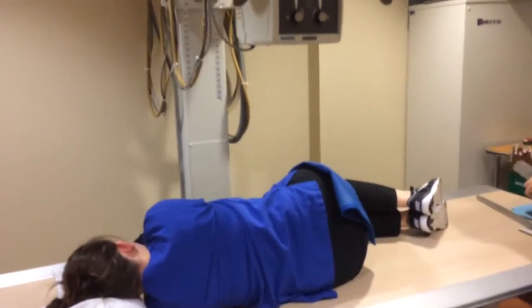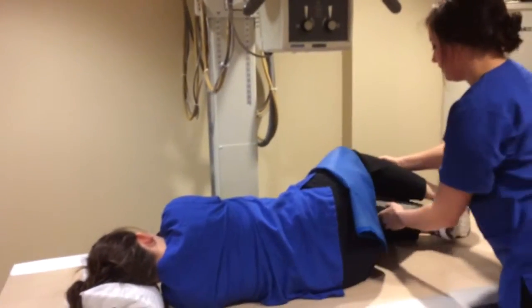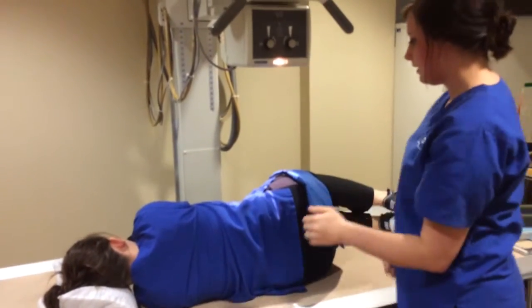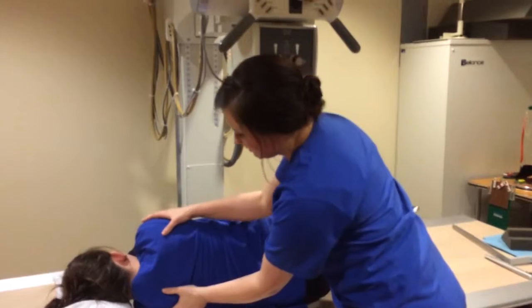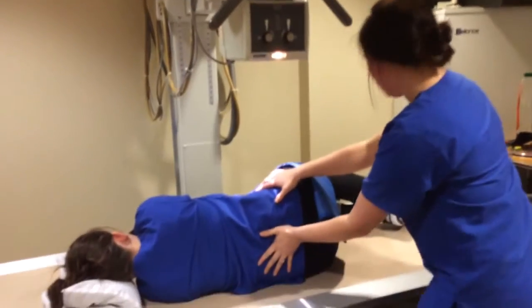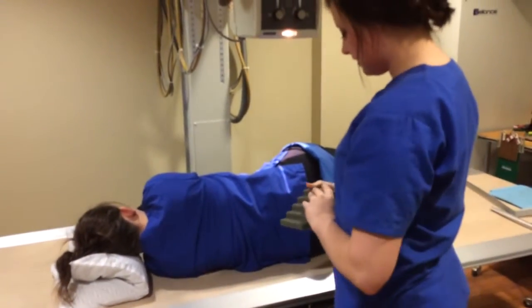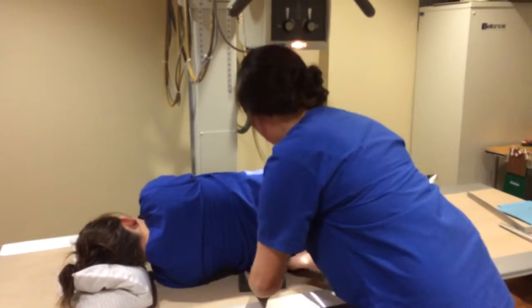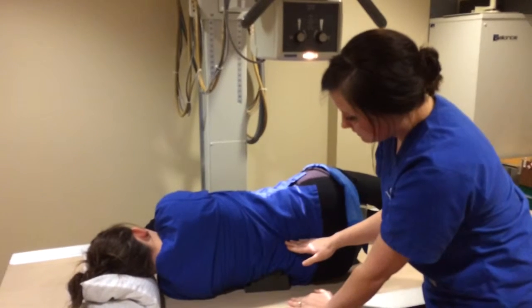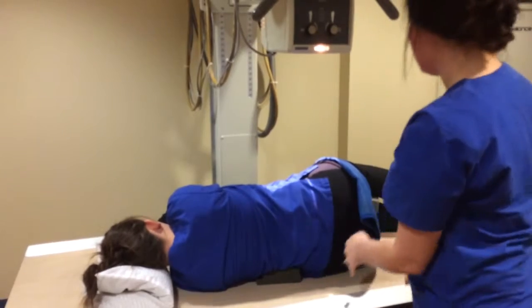I am going to place a sponge in between her knees to ensure that there is no rotation of the pelvis, which is more common to happen if you don't have the sponge in females because of the wider hips. I'm going to make sure that both of her shoulders are on top of each other and her hips are on top of one another in a true lateral position. I'm going to take this hand sponge and compress it and lift her side up and just put that under. This way the spine is parallel to the image receptor, so it doesn't dip down, which the sponge helps with.